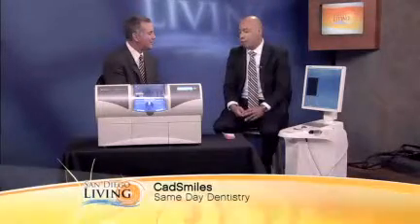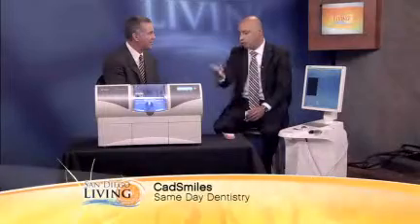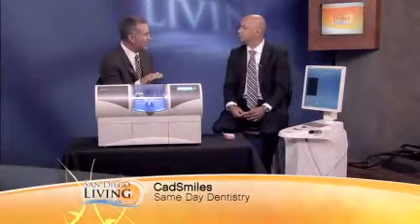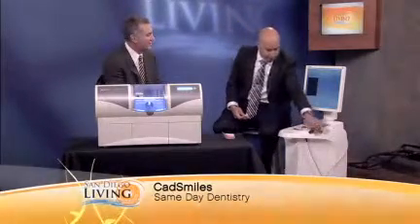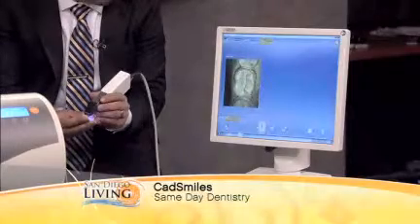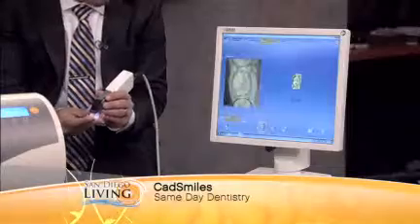So today, I wanted to show the audience how this machine can communicate with this one over here to create a tooth in one day. Okay, so normally you have to go through impressions and models have to be made. You're able to short-circuit that process, skip that altogether, aren't you? Correct. We use this wand, this little scanner here. And if you see here, I just turn the camera on. Let's pretend this is a patient's mouth. Okay, so you would take a picture of somebody's tooth in their mouth. Correct. As it exists.